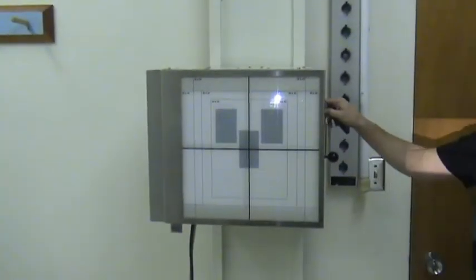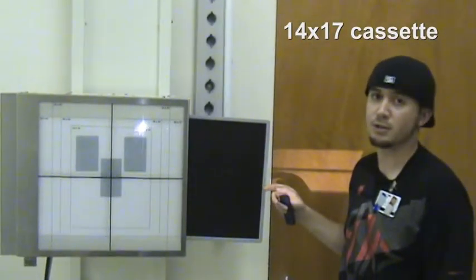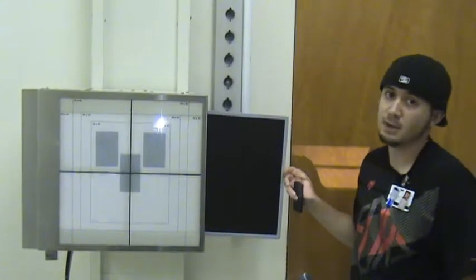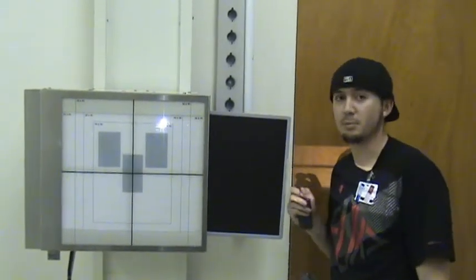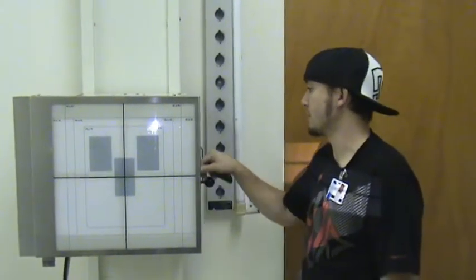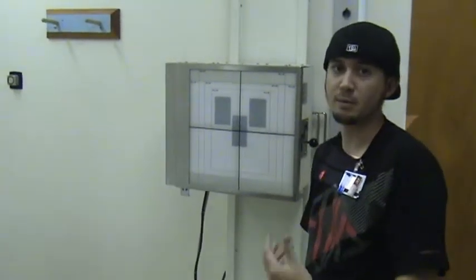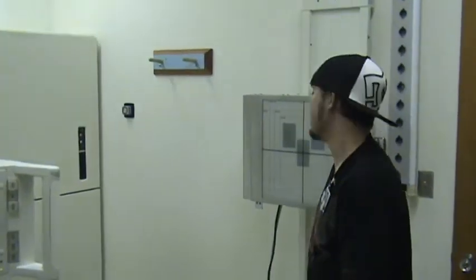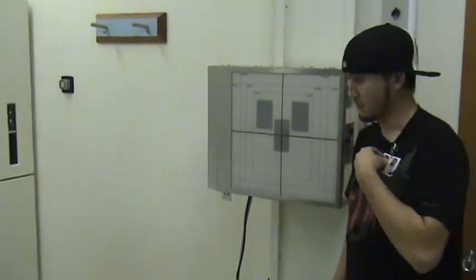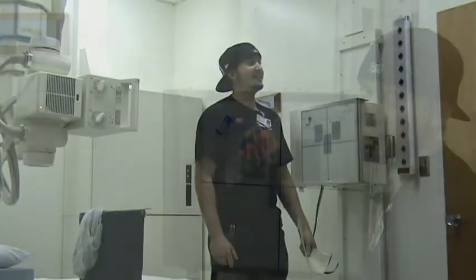Also, you want to make sure that you have a film in here with the marker of the film on the right side of the patient, or if you're doing it portrait-wise on a PA, which you could on skinnier people, it'll be on the top portion. So we're going to make sure that's in there. Once you put it in on automatic tubes, you'll see that it'll detent to the square of whatever film you put on there, whether it be landscape or portrait. Also, put your left marker on here, just in the general area, so you don't forget when you bring in the patient.